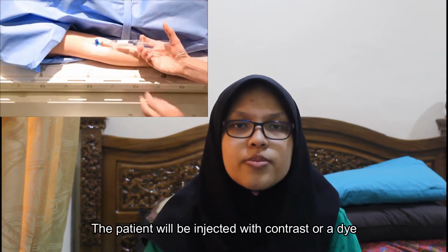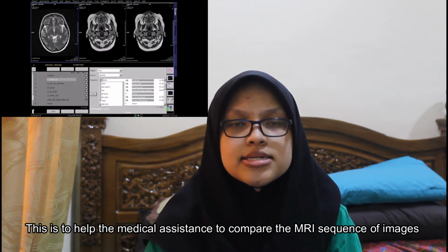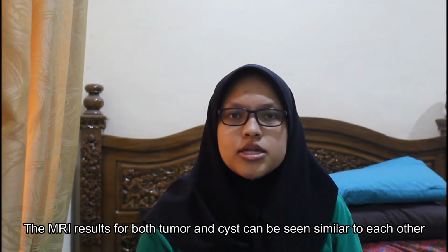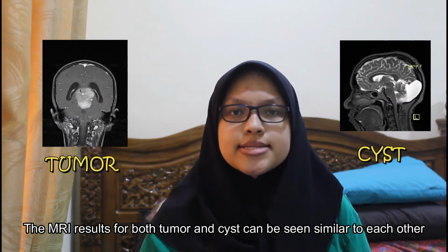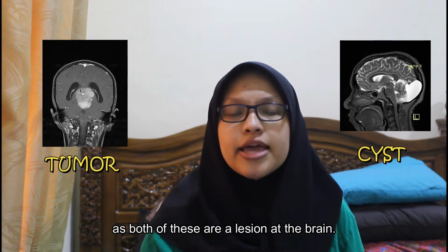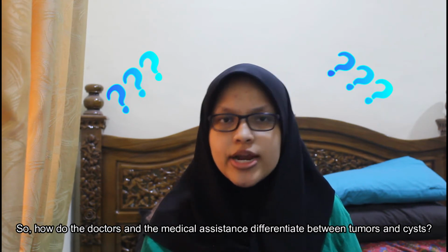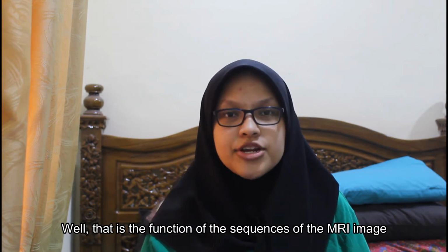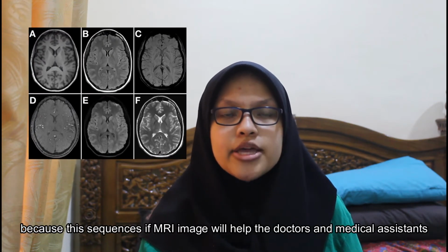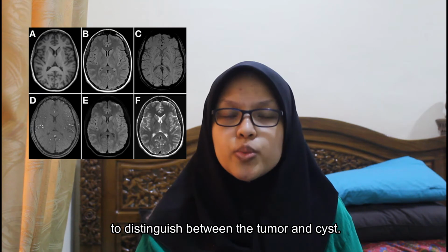The patient will also be injected with a contrast or a dye. This is to help the medical assistant compare the MRI sequence of images with and without contrast. The MRI results for both tumor and cyst can look similar to each other, as both of these are just a lesion in the brain. So, how do the doctors and the medical assistant differentiate between tumor and cyst? Well, that's the function of the sequences of the MRI image, because these sequences will help the doctors and the medical assistant to distinguish between the tumor and cyst.